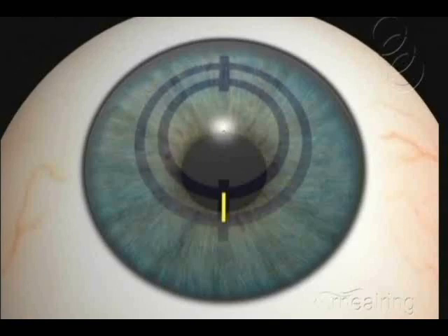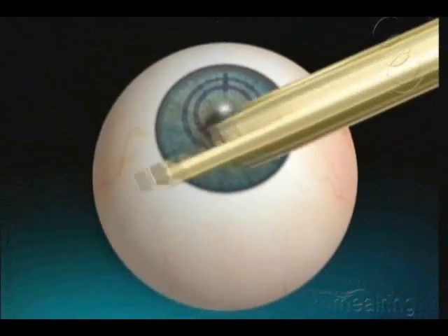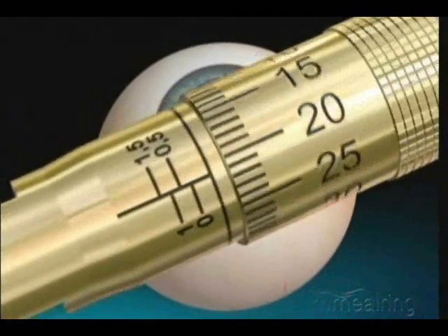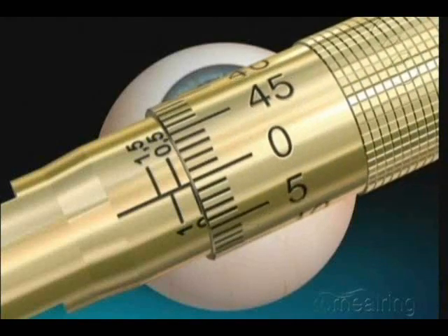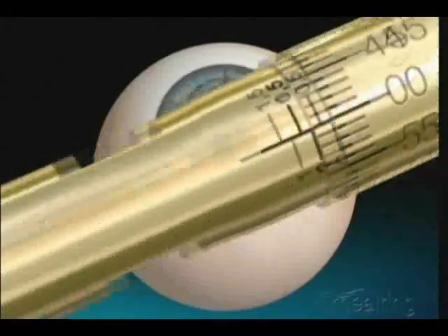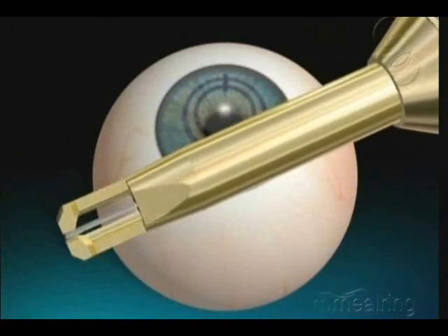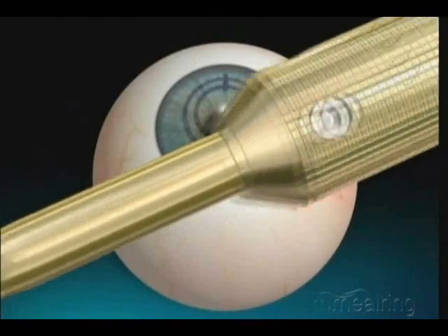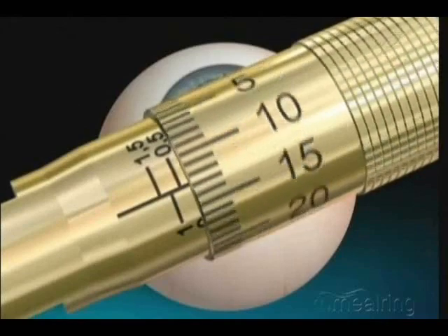Make the incision right on the steepest meridian. Calibrate the surgical knife blade to zero microns. Check the blade on the microscope to ensure the correct zero position. Now adjust the blade size to 75% of the corneal thickness at the incision site.